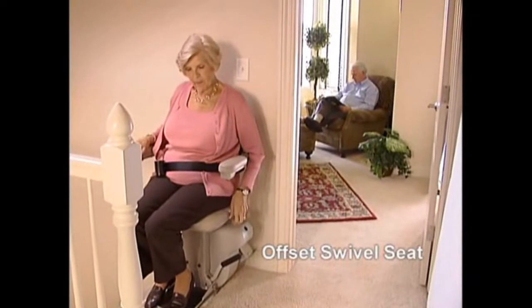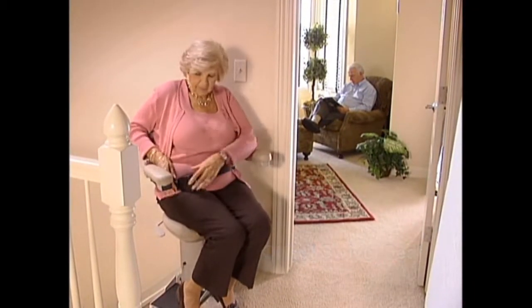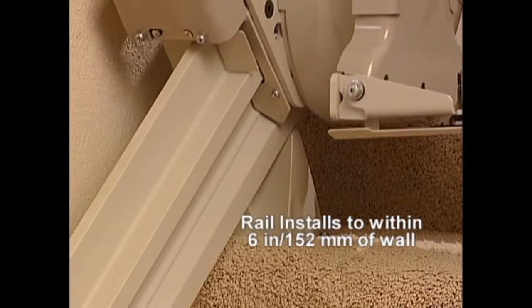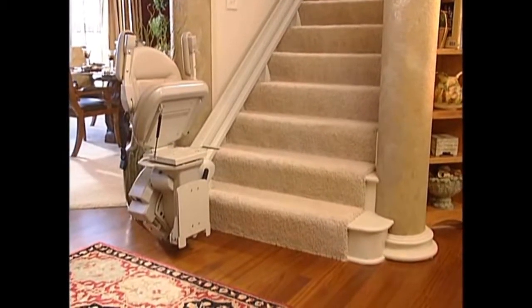The new Offset Swivel Seat makes the entry and exit position at the top landing safer and easier than ever. A sleek vertical straight rail installs to within 6 inches or 152 millimeters of the wall, so family members and guests will have no problem using the stairs.